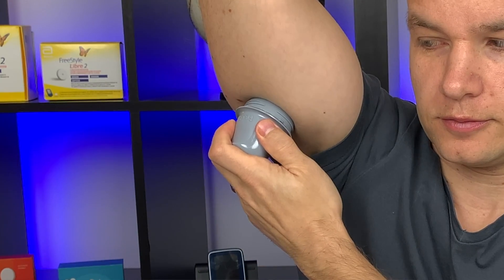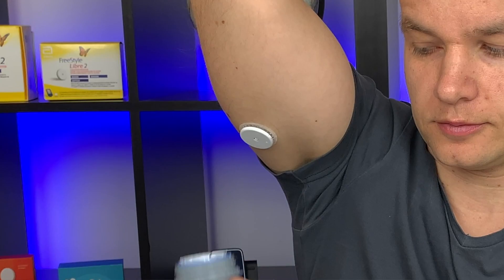Tip number six: don't calibrate the Libre sensor during the first day you have it on. Libre sensors tend to be less accurate during the first 24 hours. You only want to calibrate when your body gets used to the sensor and your readings normalize — that's typically starting on the second day of the sensor.